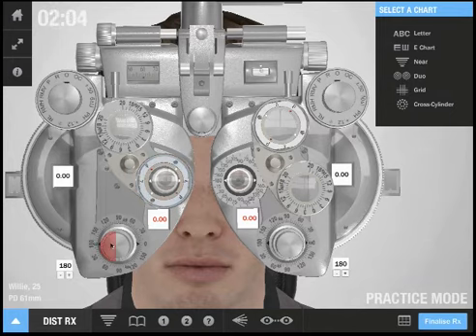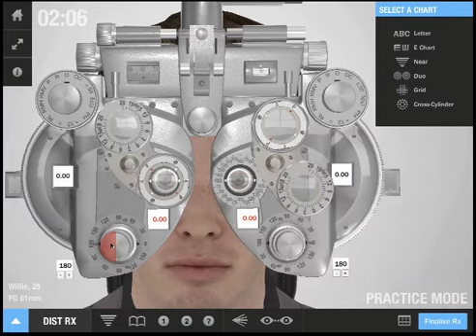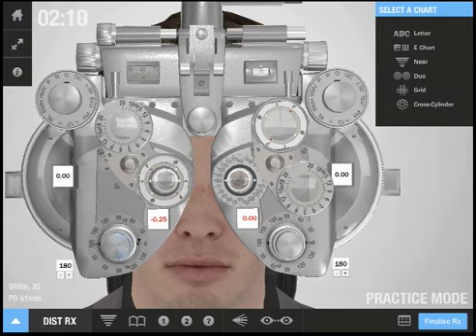Here I can increase or decrease the amount of cyl power. And I can adjust the angle of the cyl.